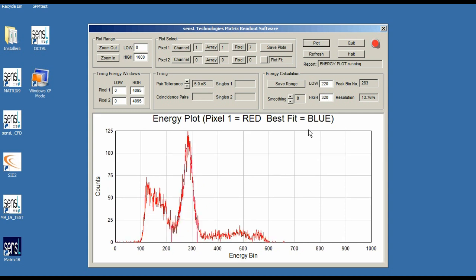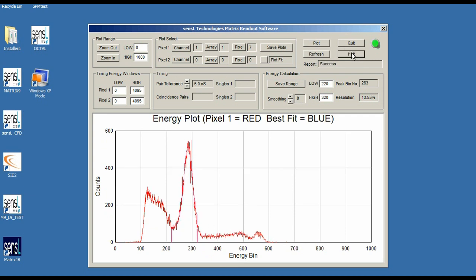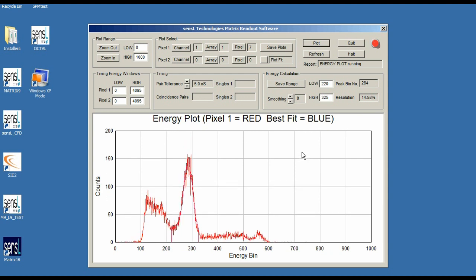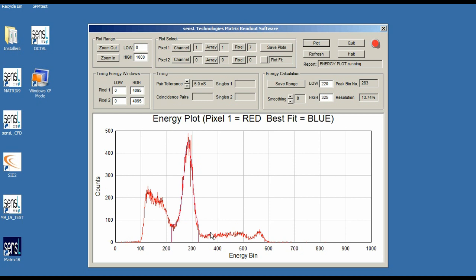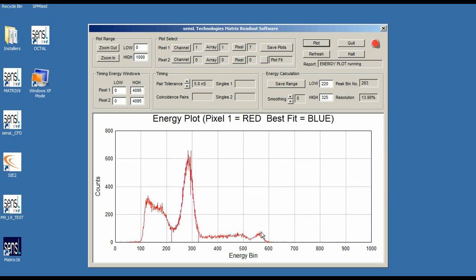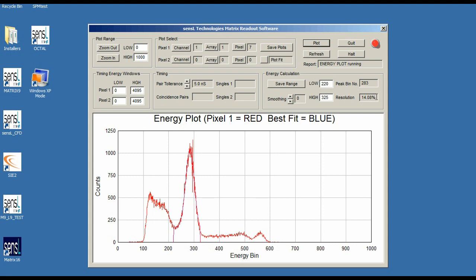That looks a lot better, but I'll raise the high setting slightly to 325, save it, and re-plot. We have a very nice consistent-looking curve coming out of the software. We can see the 511 keV peak, the Compton continuum, and the 1.2 MeV secondary peak from the sodium-22 source — all working very well.